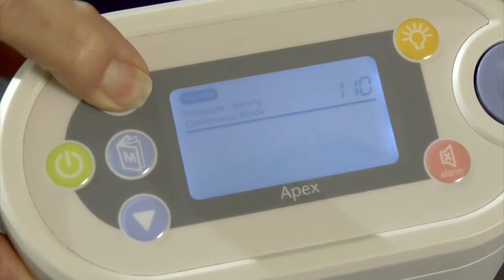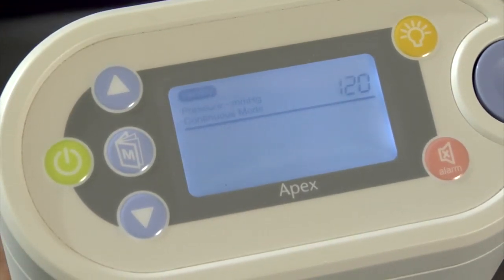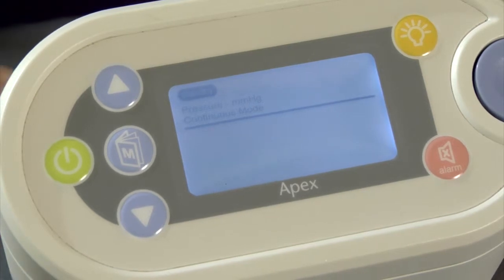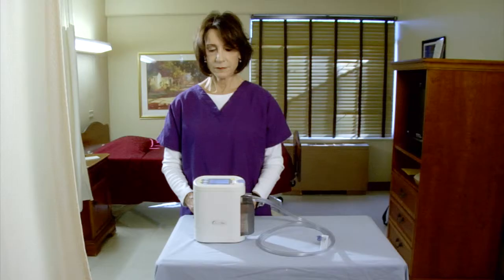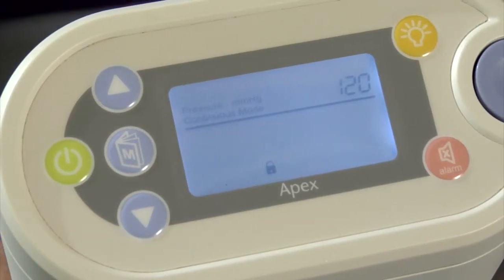Using the up and down keys, you can select the amount of negative pressure you desire in 5 mm mercury increments from 20 all the way up to 150 mm mercury. To exit the programming menus, push the power button. Now the system is locked and on standby. To begin therapy, activate the system, press the green power button again, and you will visually see the system activate with the circle rotating. Now that wasn't hard.